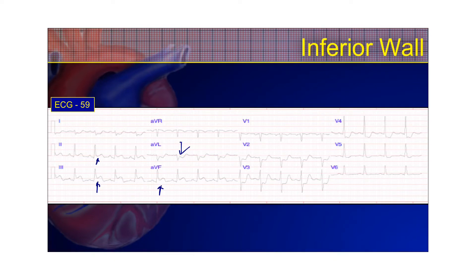You could go further and see ST depression in some of these anteroseptal leads, which is indicative of a posterior wall infarction because this is a dominant RCA occlusion. The inferior wall is infarcted while not much of the lateral wall is involved, and you have a posterior descending artery pattern — so it's probably not a left circumflex occlusion but most likely a dominant RCA occlusion.